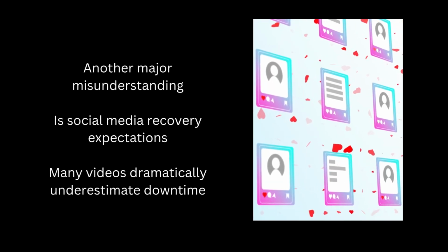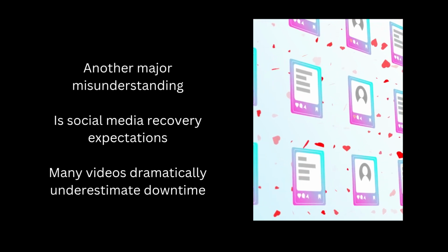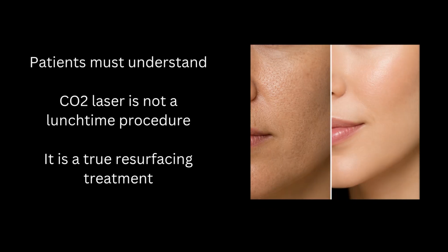Another major misunderstanding is social media recovery expectations. Many videos dramatically underestimate downtime. Recovery may involve redness, swelling, crusting, sensitivity, and prolonged pinkness, sometimes for weeks. Patients must understand, CO2 laser is not a lunchtime procedure. It is a true resurfacing treatment.